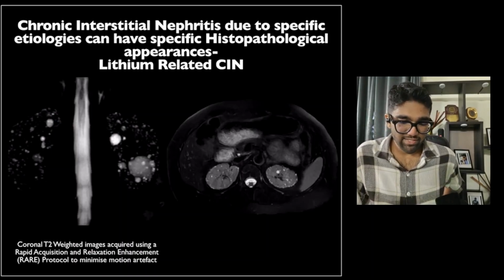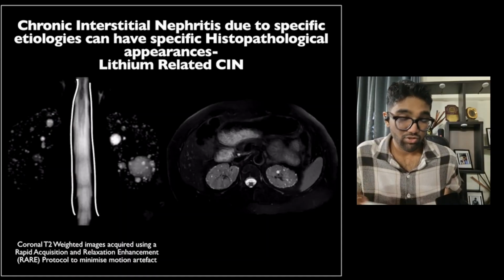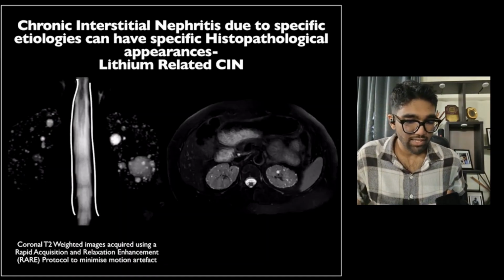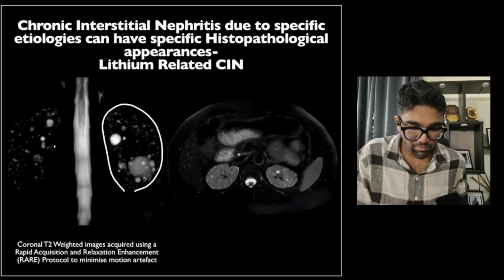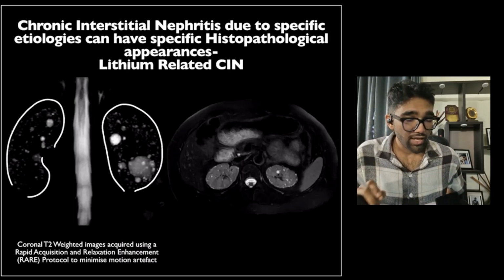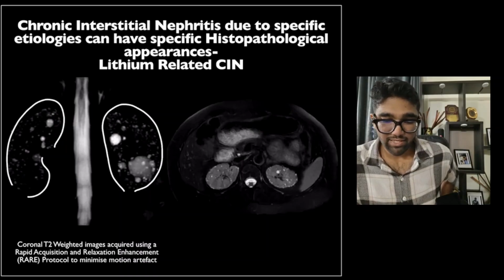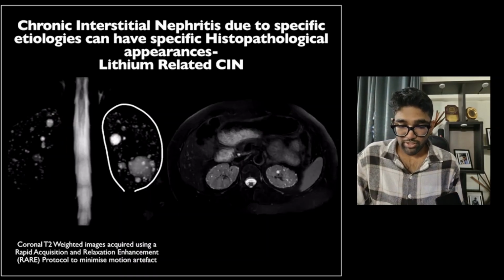So what you find is that obviously this represents your spinal column and the fluid within the spinal column. This being a T2 weighted image, that is white, and these are the two kidneys. Now, very importantly, within the kidneys, what you find are multiple small, discrete cysts, and these cysts are obviously full of fluid, and that is why they show an increased intensity on T2 weighted imaging.